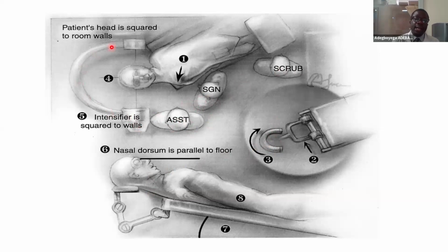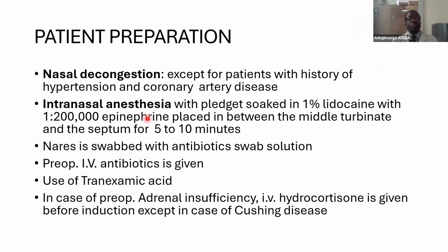This imaging intensifier is used when you want to use a microscopic method. This is not needed in an endoscopic approach. The preparation of the patient starts by doing nasal decongestion.